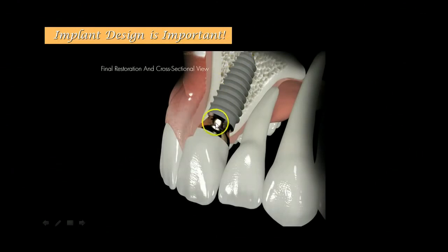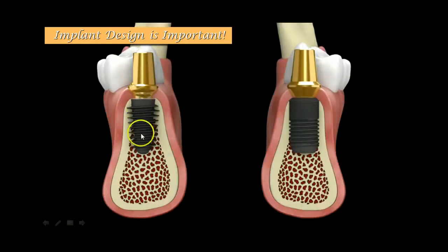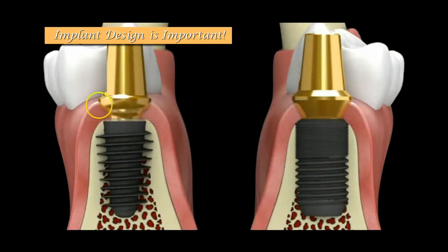Now here, again, you see an anterior case, especially in the anterior, this type of not only initial stability, but where you countersink the implant, and the design of the implant is key. Because when you place an implant in the anterior, you typically place that 1 millimeter lingual to the cingulum of the adjacent teeth, as you can see here. Now, we talked about the biotypes earlier, and again, you want to maintain that buccal plate by adding just a little bit of bone there as well. Okay, you're able to do that easier with these designs of implants, again, because of the lesser amount of bone that you're removing with the increased stabilization with the thread designs. All right, and again, a macro view of that. So again, double offset, everything that we just talked about, I went into great detail with that.